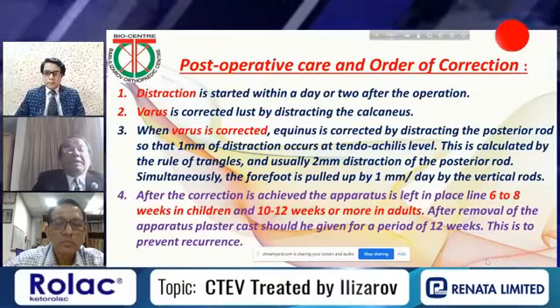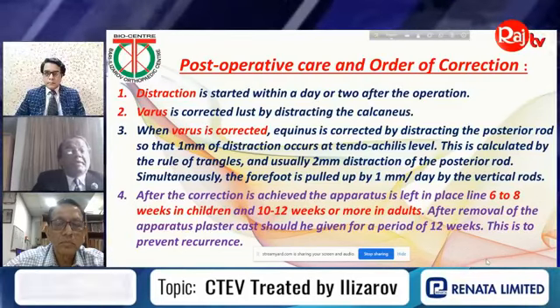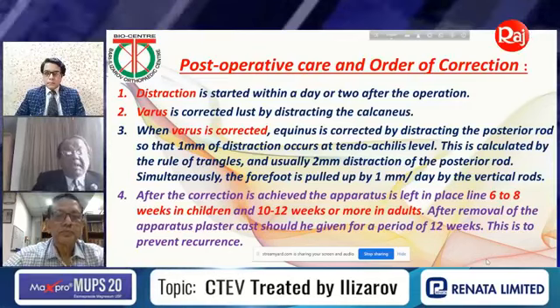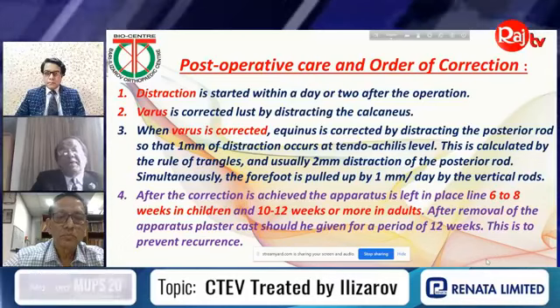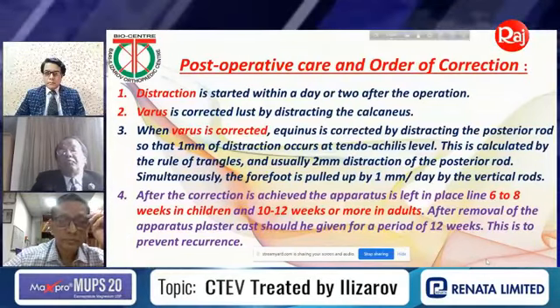Now, post-operative care is very important. Whenever you do a surgery, once you have finished, after applying the Ilizarov, you must see the apparatus, how to do the distraction. You correct the varus first. If varus is corrected, then gradually you go for distraction.